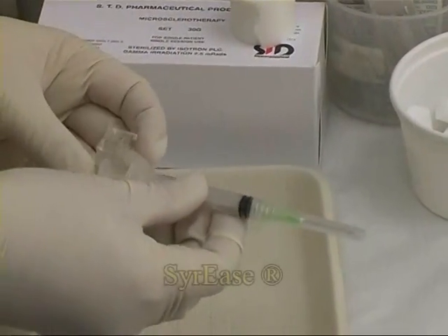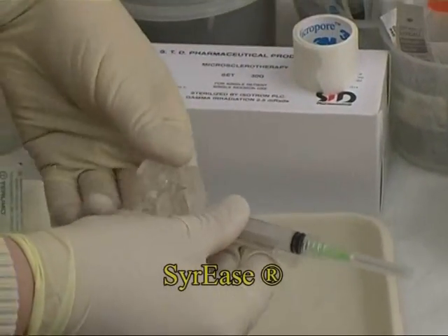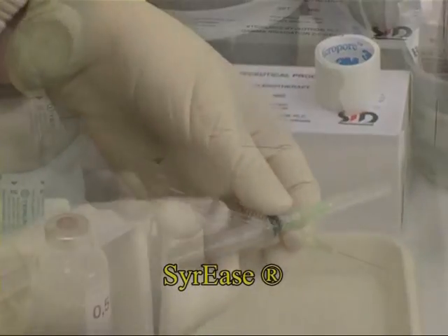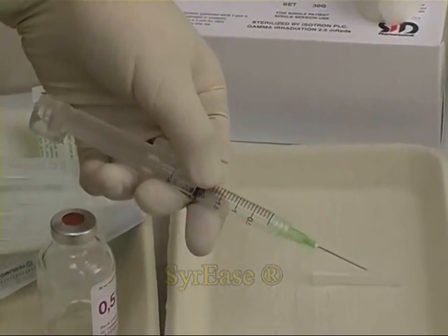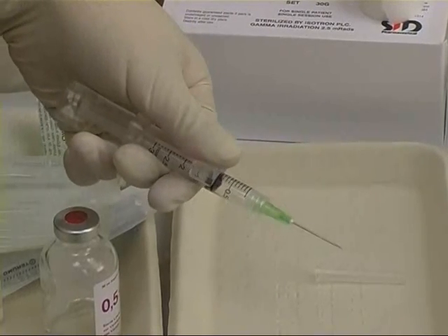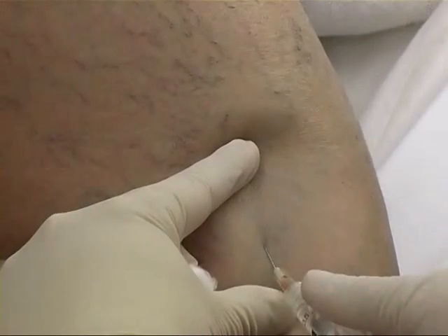Here, an experienced sclerotherapist attaches a SyrEase device to a syringe. This facilitates manipulation of the syringe with one hand and allows a more comfortable injection technique.